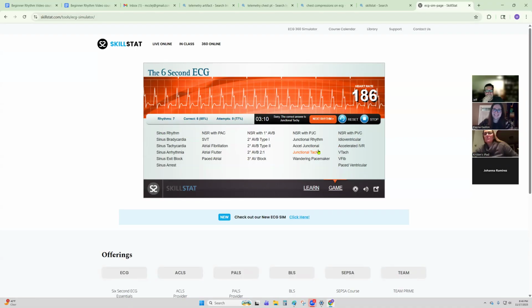Oh, actually, we saw a wide QRS the other night. But it would come out and you could see the P, and it was so weird, like junctional. Danielle's like, isn't that weird how it would make the QRS so wide? I'm like, oh, see, that's tough.